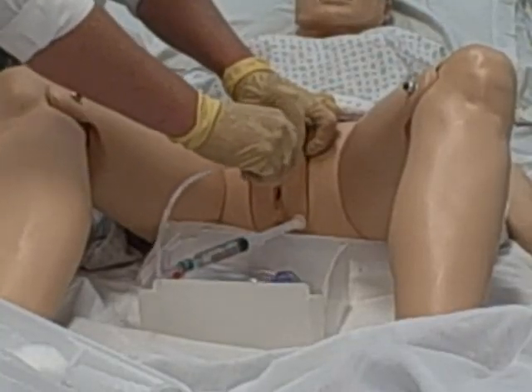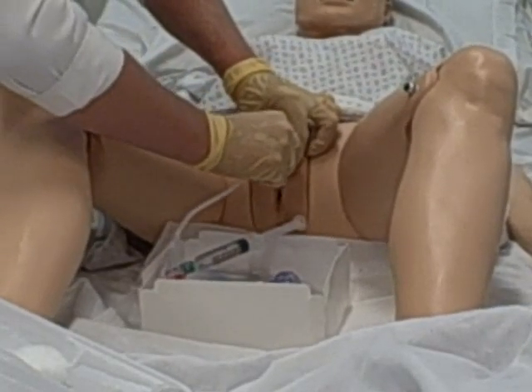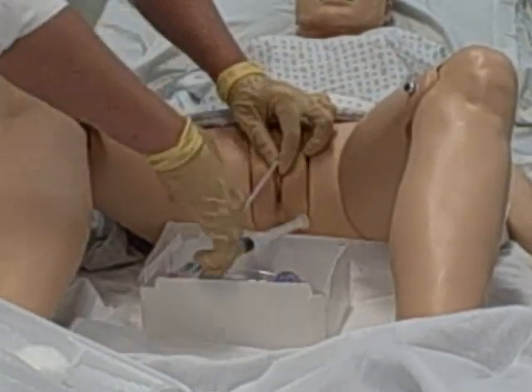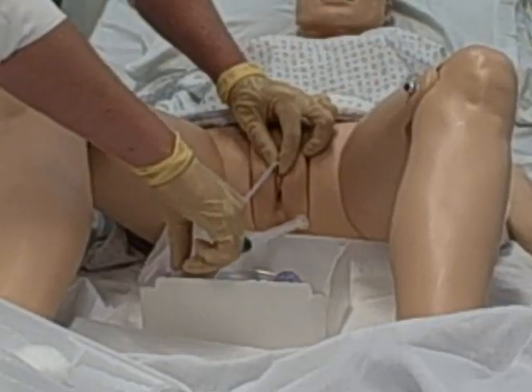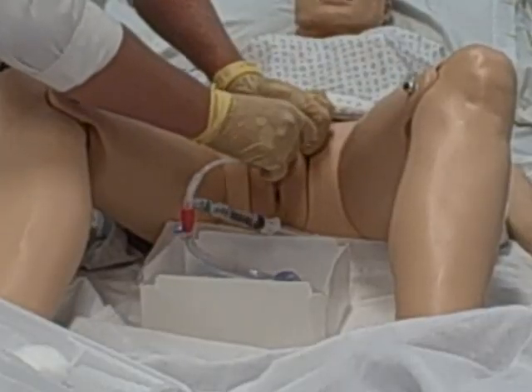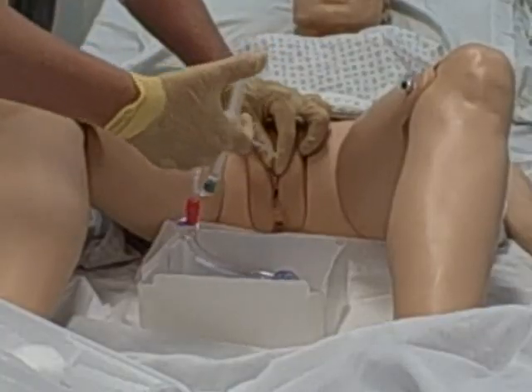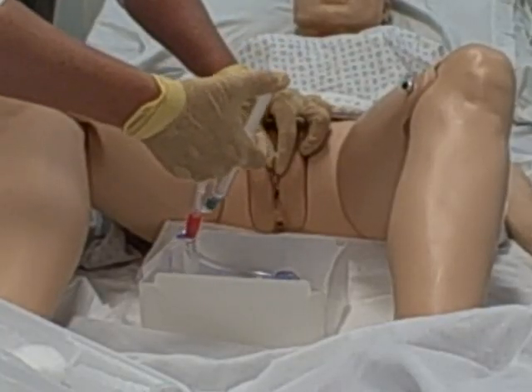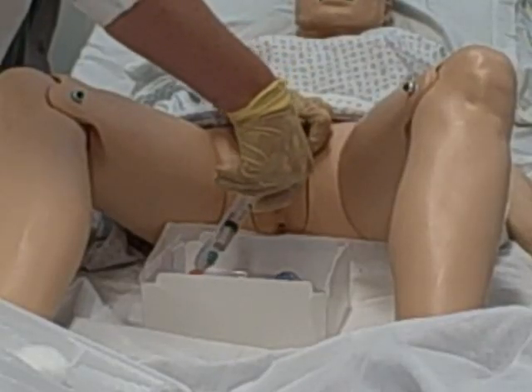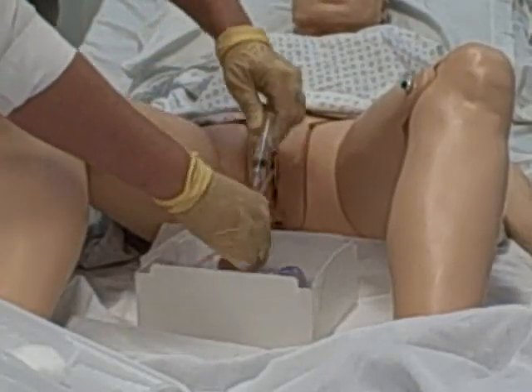I'm going to insert the catheter now — this will just take a few moments. For the female patient, we will insert the catheter until we see urine flow in the tubing, and then an additional one to two inches. For a male patient, we will insert the tubing until we meet the bifurcation, at which point we will inflate the balloon. This will hold the catheter in the bladder. The syringe is then removed.